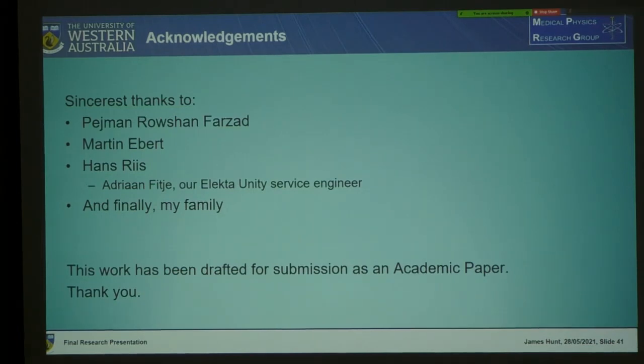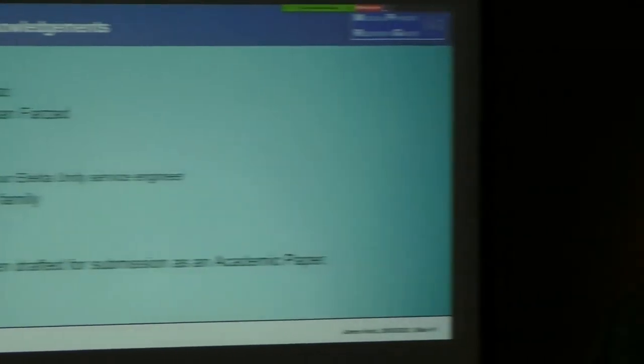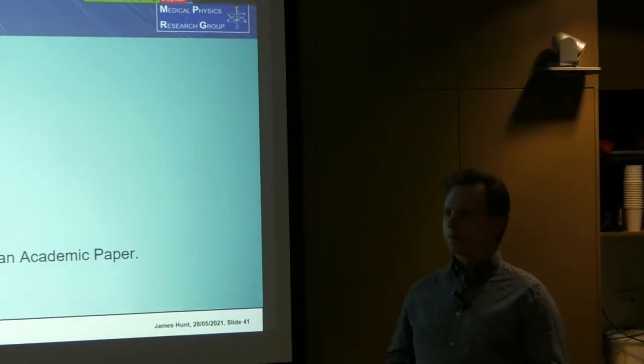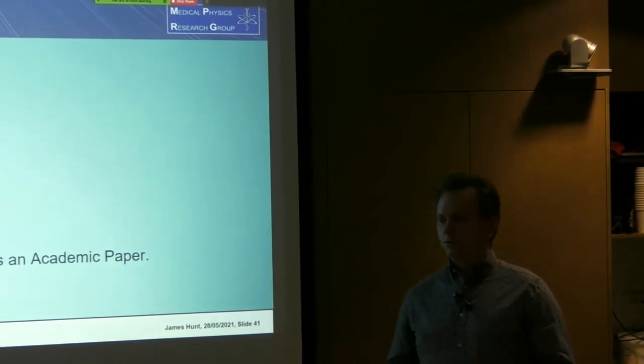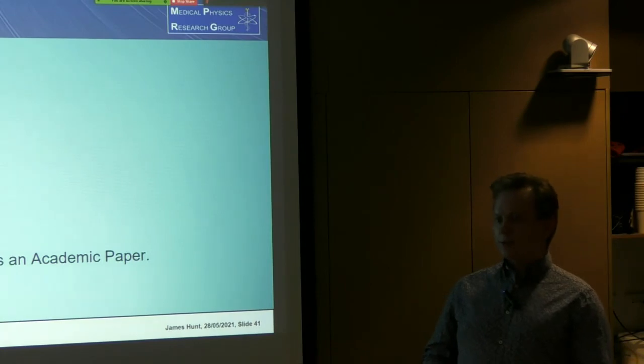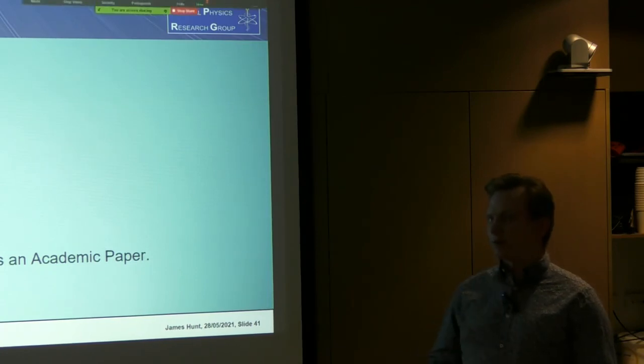Are there any potential improvements to the Phantom which would make it easier to analyse? Easier to implement, like to install? I mentioned it was hard to install. Or the circles were a little bit unclear in the image. We tried to boost the contrast by changing the material, and that didn't really have any effect, which is why I grouped all the results together. There was no noticeable difference.